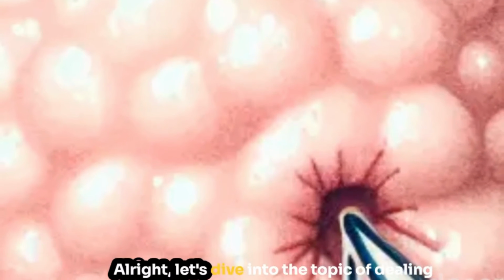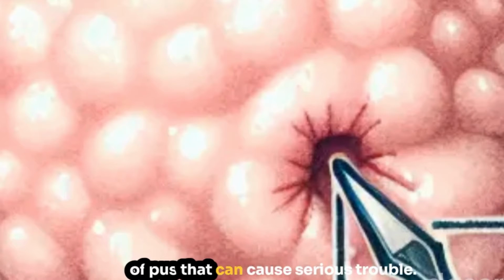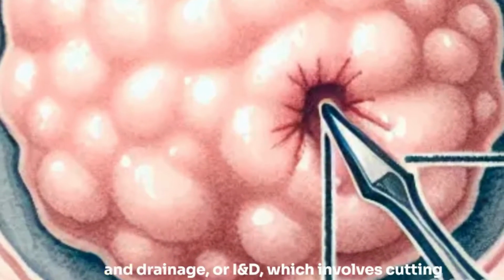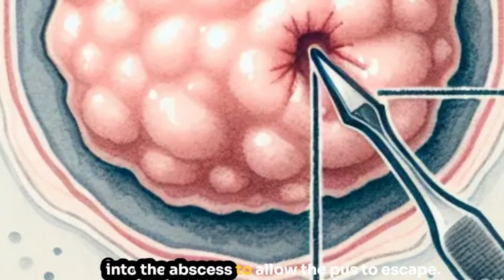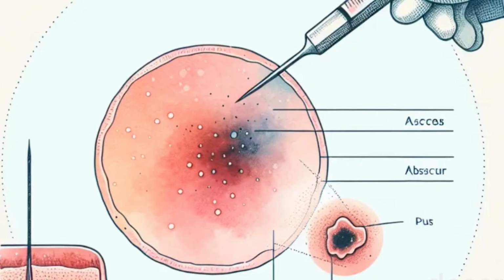All right, let's dive into the topic of dealing with abscesses, those nasty pockets of pus that can cause serious trouble. Today, we'll go through the procedure of incision and drainage, or I&D, which involves cutting into the abscess to allow the pus to escape. We will explain what an abscess is, how to identify one, the process for performing an I&D, and discuss how to handle any complications that may arise.